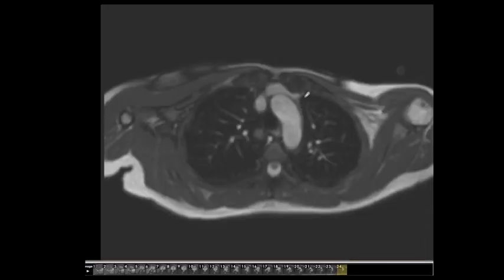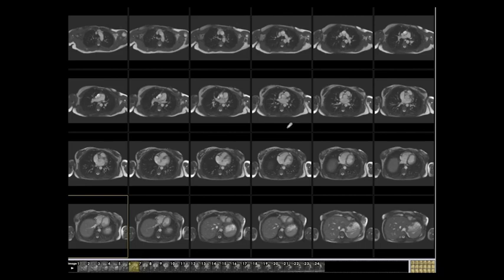We can acquire any localizers again in any direction, not as HASTE, but as TruFISP again. So again as gradient echo, where the blood is bright, and this helps you to better localize blood vessels and see the connection, and sometimes it helps you to describe extracardiac abnormalities.